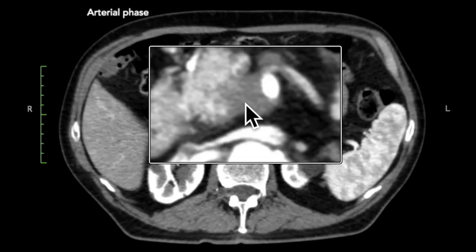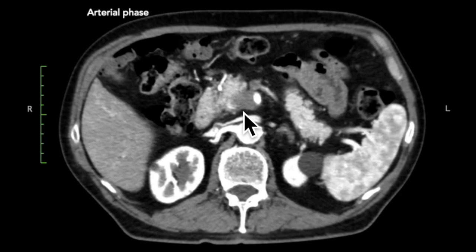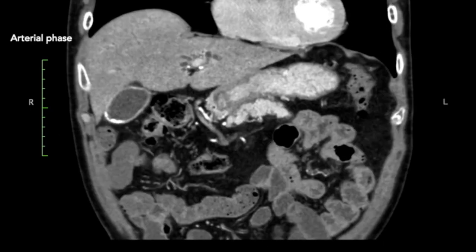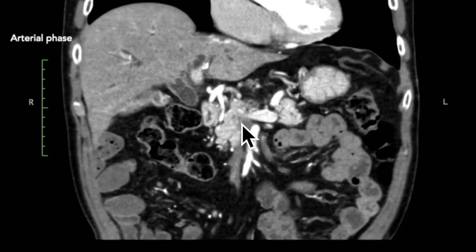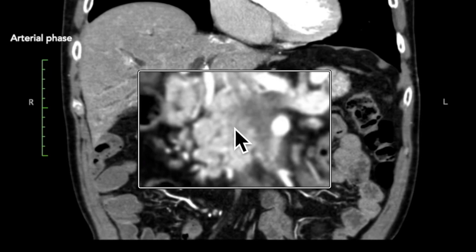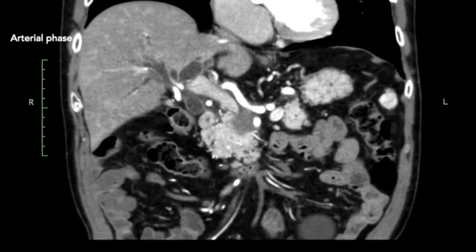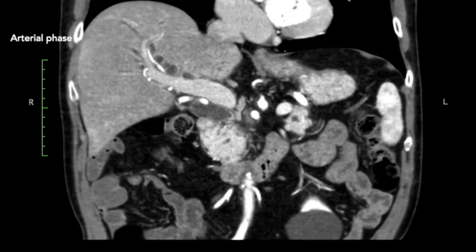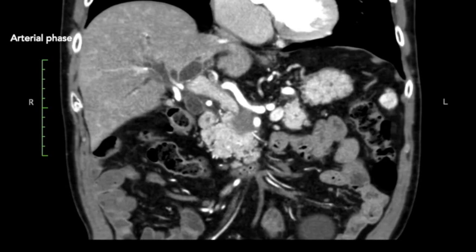At the level of obstruction, we can identify an obstructing lesion. It is a solid lesion, hypovascular. For some overview, the coronal reformat shows dilatation of the main pancreatic duct up to the level of the head of the pancreas — probably only slightly dilated because it runs just lateral to the lesion — and dilatation of the bile ducts, both intra-hepatic and extra-hepatic, up to the head of the pancreas with the obstructing lesion here.